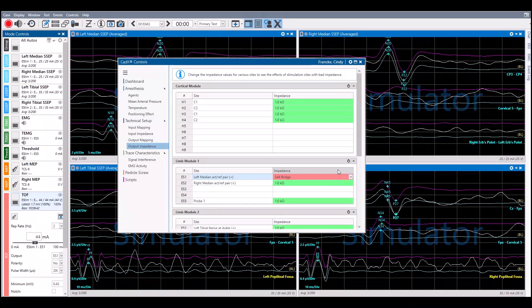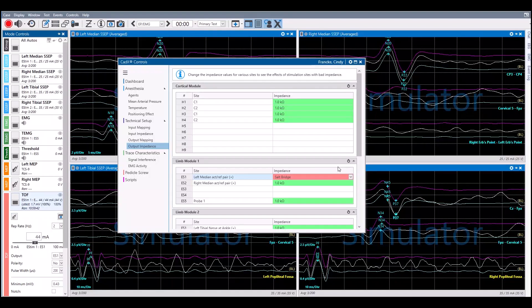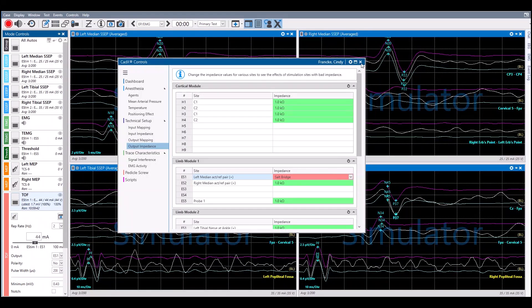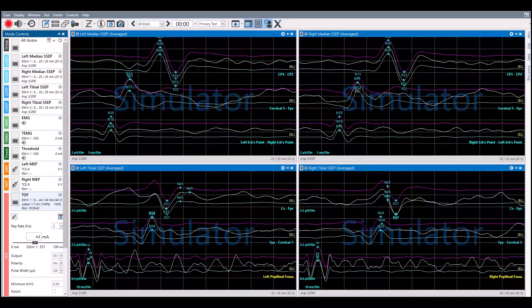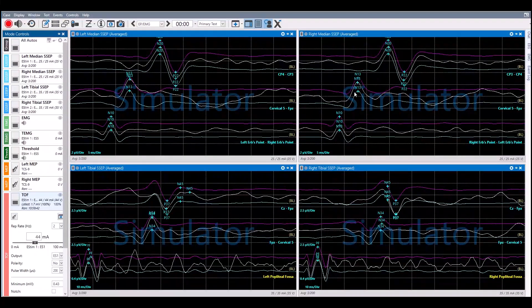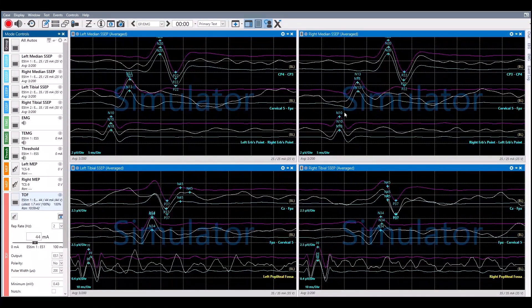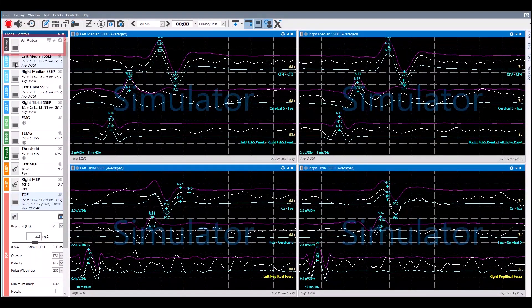The changes can be visualized on the mode or modes that the affected electrode is being utilized for in stimulation. In this instance, the modes are the Left Median Nerve SSEP and the Train of 4.